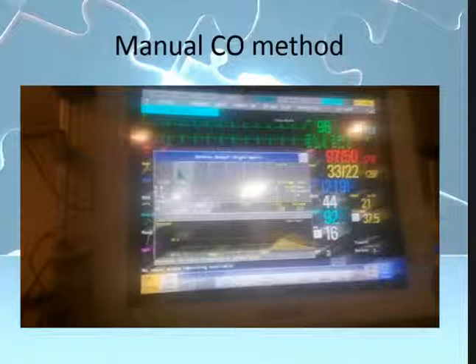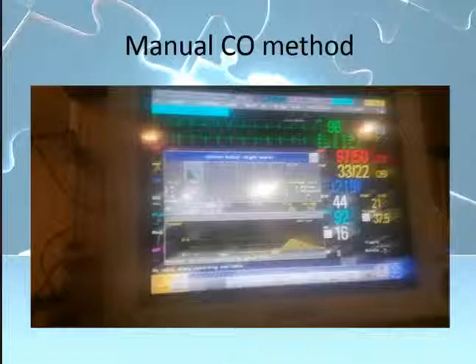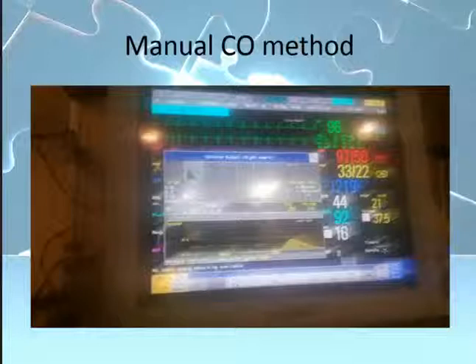Alright, hopefully you're still with me, and I hope that you watched that video because I felt like they did a very good job of troubleshooting tips. And not just for the Swan catheter, they talked about the dynamic response, the square waveform test. That's good for arterial lines and that's good for CVP lines as well. If you have an overdampened or underdampened arterial waveform, it's good to do that square wave test.